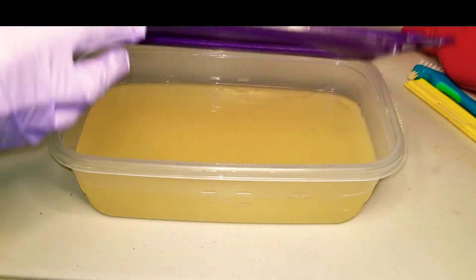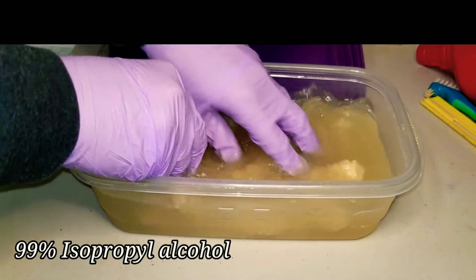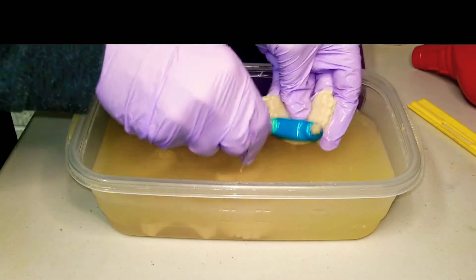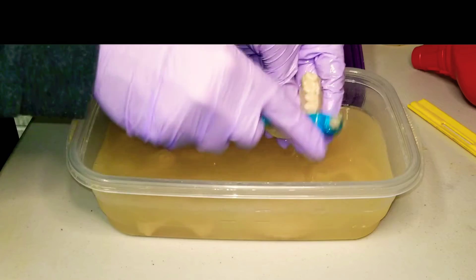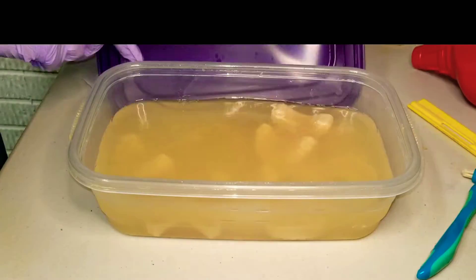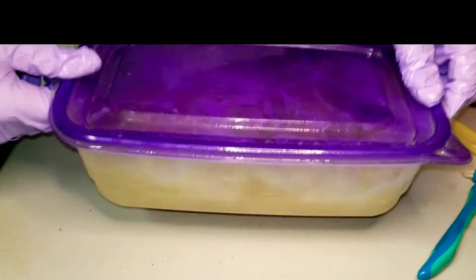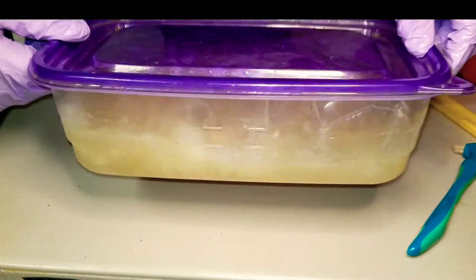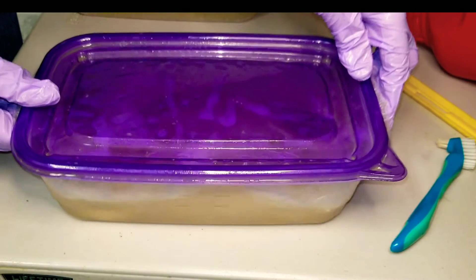In this next step I put the models in a dirty wash IPA. You can give them a quick scrub — this will rinse off any extra excess resin. And also you can do what I like to do: just give them a little shake. I found these ziplock containers at Target and they work wonderful because you can shake them and they don't leak. This shaking process I usually do for about 30 seconds and then we move on to the next step.